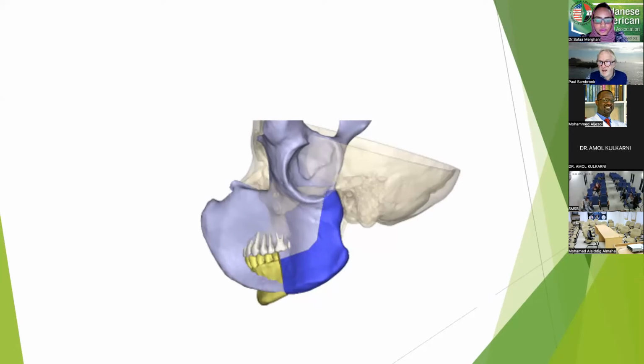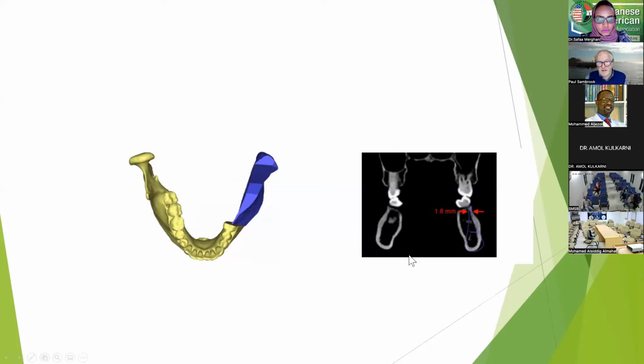We need to be looking at replacing the masticatory apparatus. That means teeth, bone, and soft tissue. Sometimes we can't, but if that is our aim, we should be able to look at doing that. As you can see here, this reconstruction would realize that the graft transplant is placed far too buccal for us to use for decent reconstruction. It needs to be inset further.